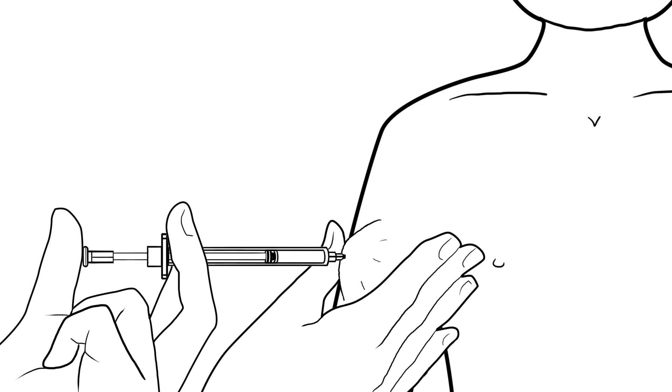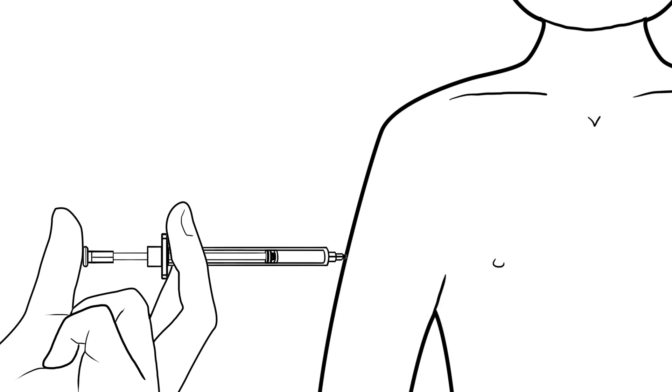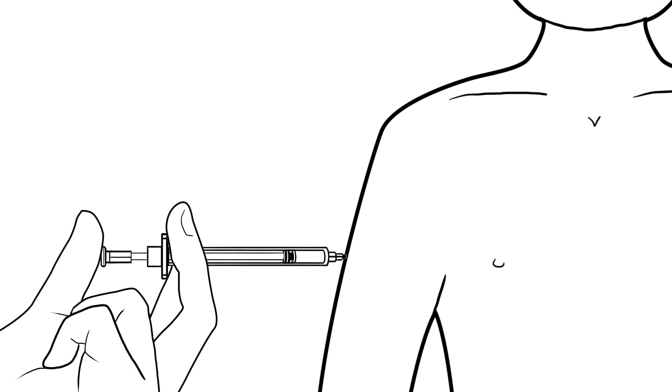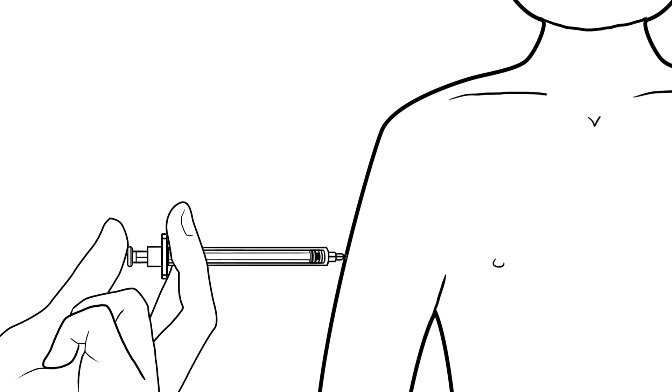Step 5: If the skin is pinched, release the pinch. Push in the plunger of the syringe at a steady speed until the syringe is empty.